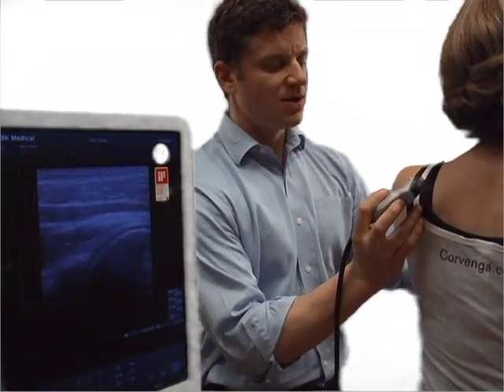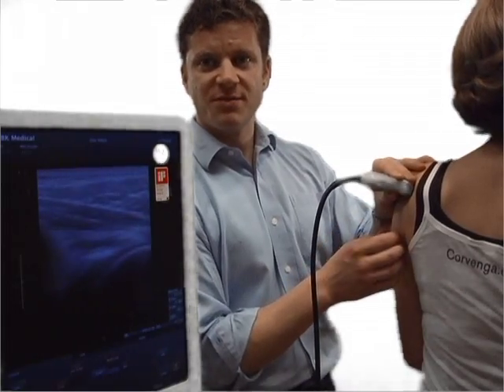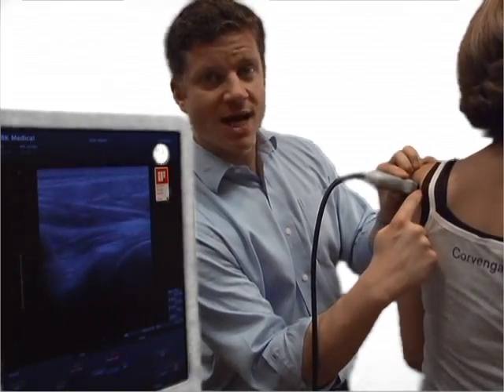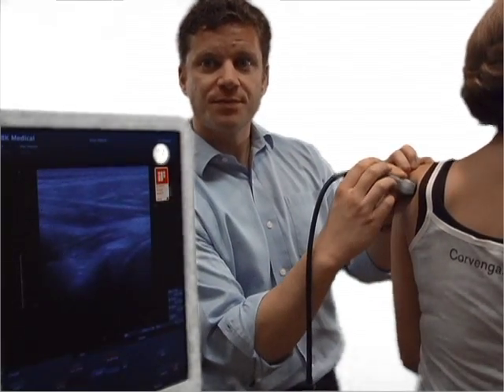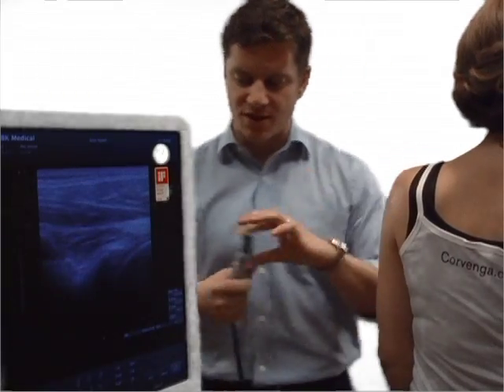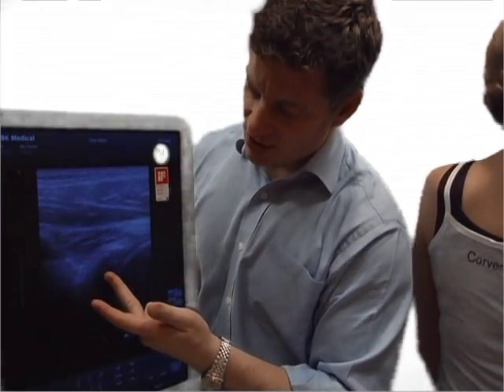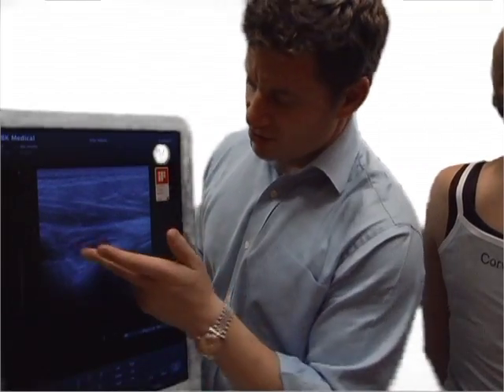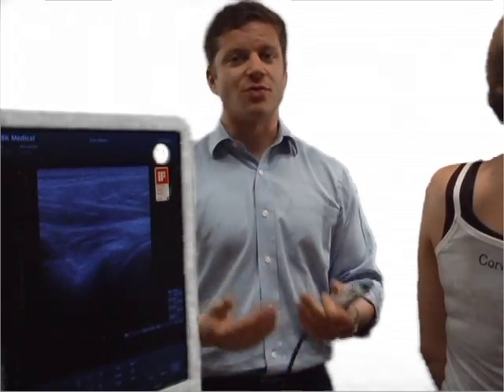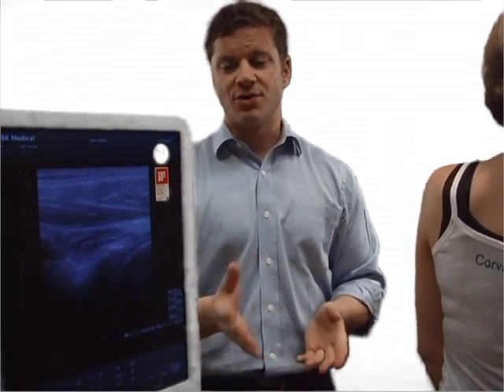The other technique is the medial injection approach. You capture the same view, then take your needle from the medial side, traveling lateral. With this technique, the patient can be in a normal sitting position and be comfortable, and your needle will travel this way — going right next to the glenoid or over top the glenoid, right next to the humeral head, injecting from that approach as well. Both are great, both work fine. Find the one you are most comfortable with and use that for the glenohumeral joint injection.